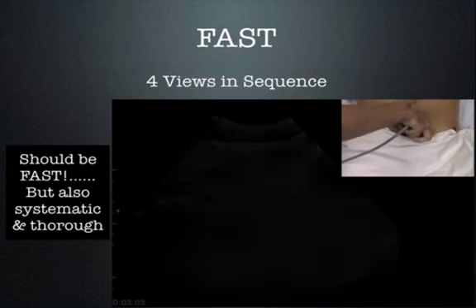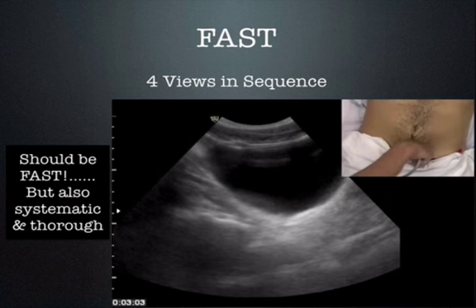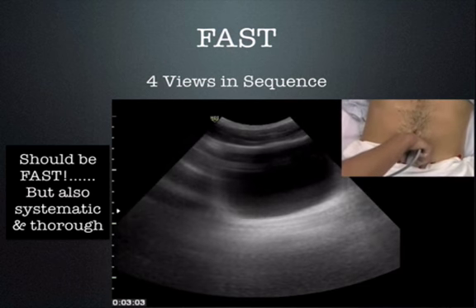And the pelvis, we see the nice hypoechoic fluid-filled bladder. We see bowel surrounding it, but we do not see any free fluid anywhere in the picture.